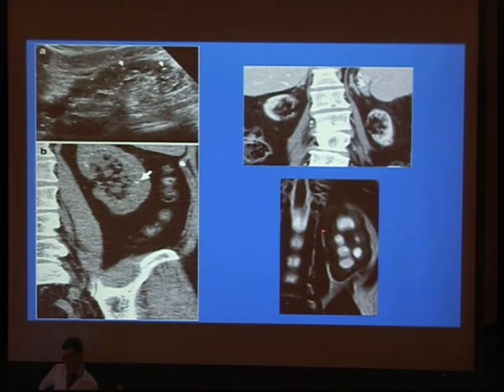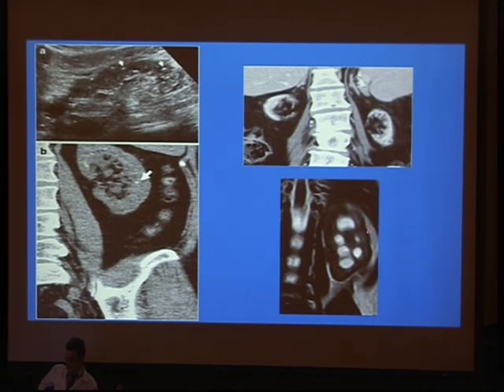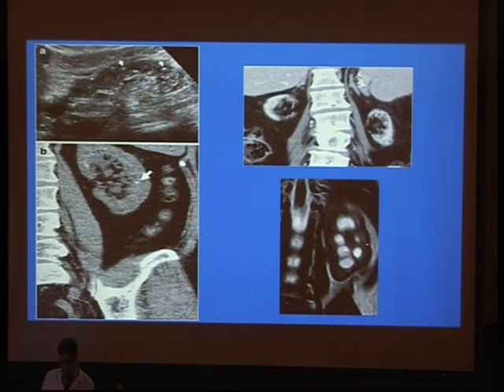MRI is a useful modality but more expensive. Without using contrast media, we can use T2-weighted MRI coronal images and find a kidney with reduced parenchymal signal intensity. This is a case of chronic parenchymal renal disease, showing dilated calyces and irregular contour.